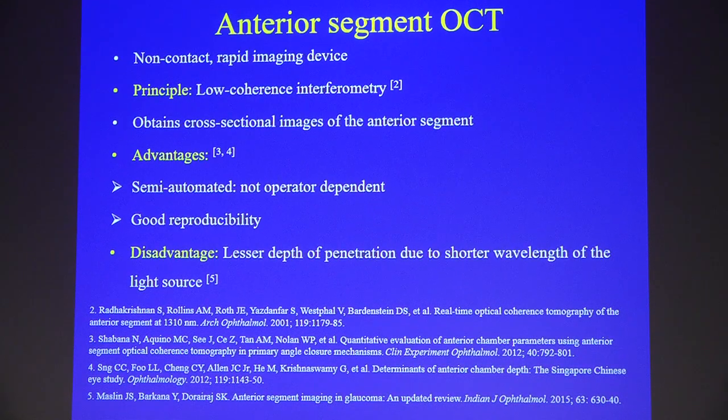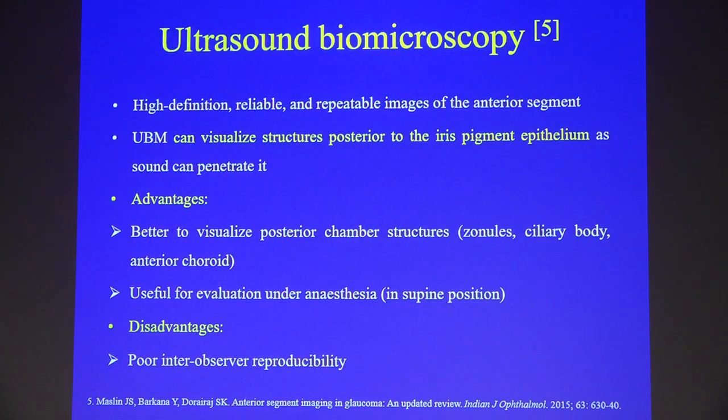My speaker's predecessors have actually done my work for all this, so I wouldn't go into the basic principles. I'll just tell you the advantages: semi-automated, not operator dependent, and has good reproducibility. Disadvantages, however, are lesser depth of penetration due to shorter wavelength of the light source.